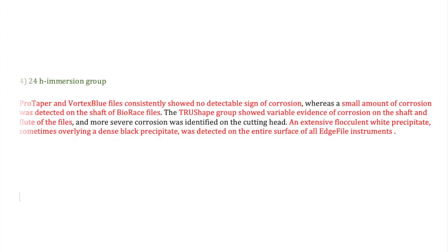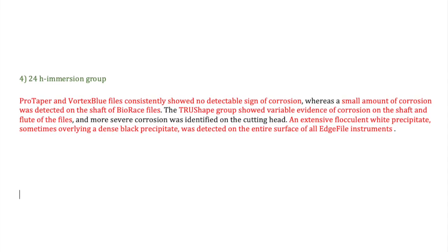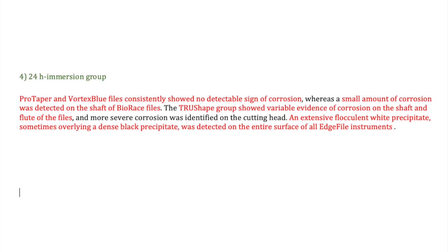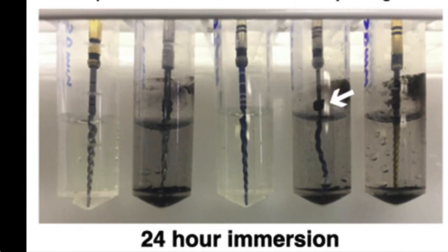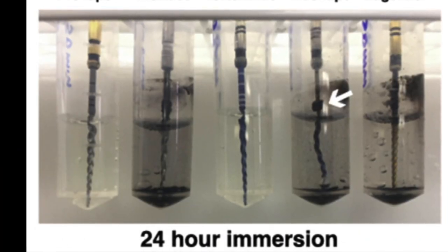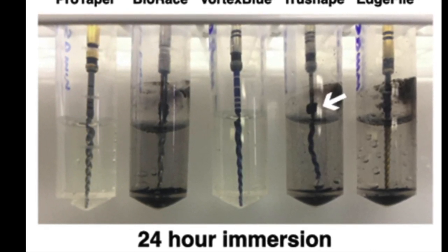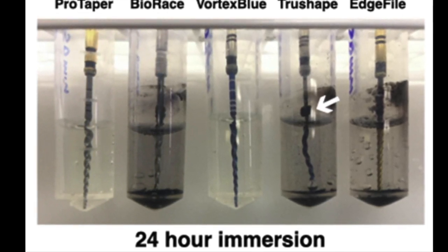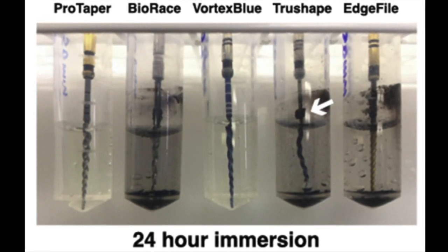For the 24-hour immersion group, ProTaper and Vortex Blue files consistently showed no detectable sign of corrosion, whereas a small amount of corrosion was detected on the shaft of the BioRace. The TrueShape group showed variable evidence of corrosion on the shaft and the flutes of the file, and more severe corrosion was identified on the cutting head. An extensive fluffy white precipitate, sometimes overlying a dense black precipitate, was detected on the entire surface of all Edge File instruments.